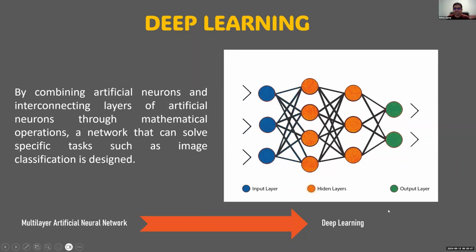So basically the layers I talked about are divided into input layer, hidden layer, and output layer. That's how it's divided. It's more complex as you read more, but because of limited time today, I would just be giving you some input on the input data, hidden layer, and output layer. All this is through mathematical operations. So we are working on a lot of algorithms on the back end that help to get you the output.